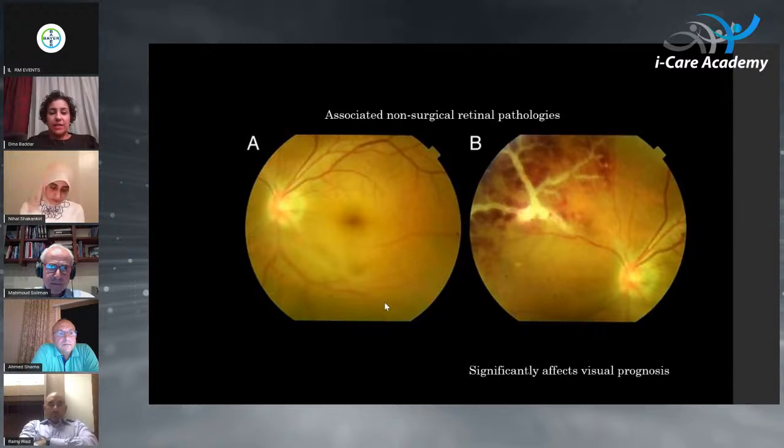All right. Excellent. Any comments from the panelists? Dr. Ramy, I know you don't do retinal surgery. If you're doing a combined cataract and retinal surgery, how do you do it in your practice? Well, if we're doing combined surgery, we do it with two consultants. The cataract refractive consultant does the phaco part, and then we transfer to the retina consultant that does the rest of the surgery.